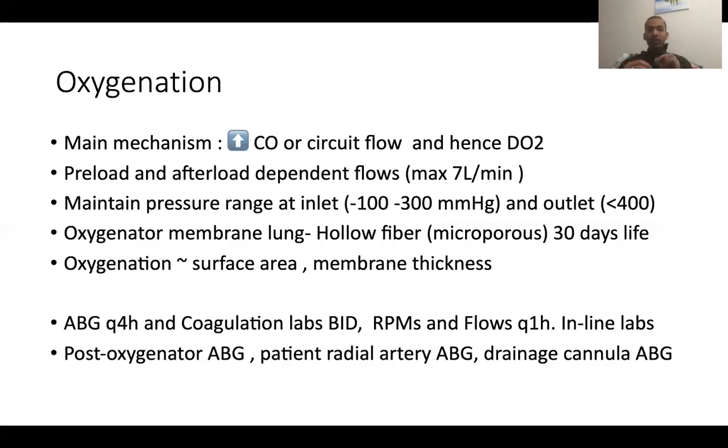Maintaining pressure ranges at the inlet and the outlet is very important, just like we have in the dialysis machines where you keep monitoring the negative pressures at the access site. Here we try to range it between -100 to -300, and at the outlet somewhere less than 400.